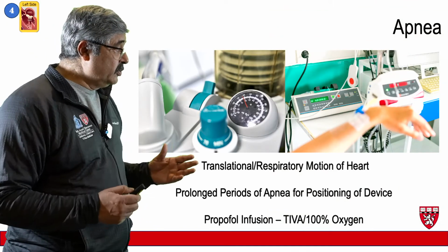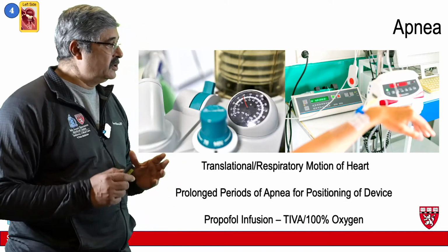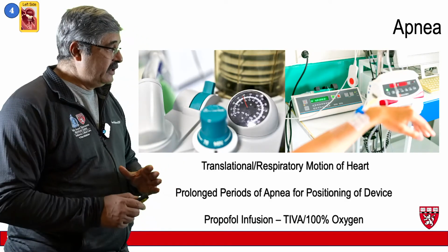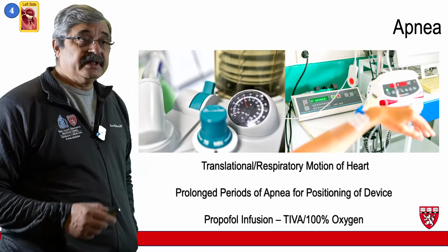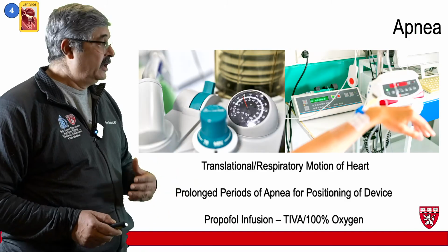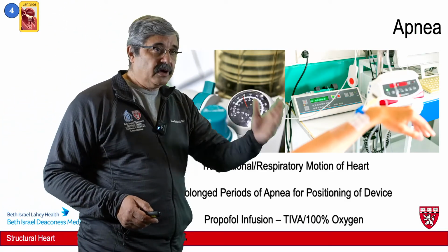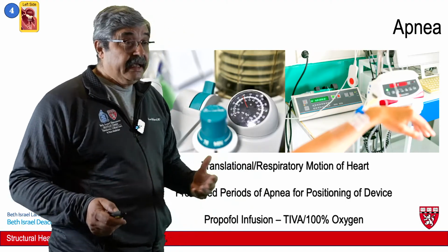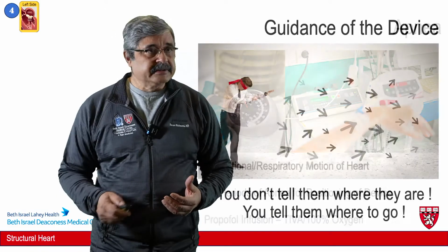Right when this is about to be done, since it is such a matter of precision, to account for the translation motion and respiratory motion of the heart, we induce long periods of apnea for positioning of the device. At that moment, you have to have a propofol infusion, a total intravenous anesthesia, and have the patient passively oxygenated with 100% high-flow oxygen so that they maintain their saturation. It can become complicated and difficult at times when you're trying to do something like this.